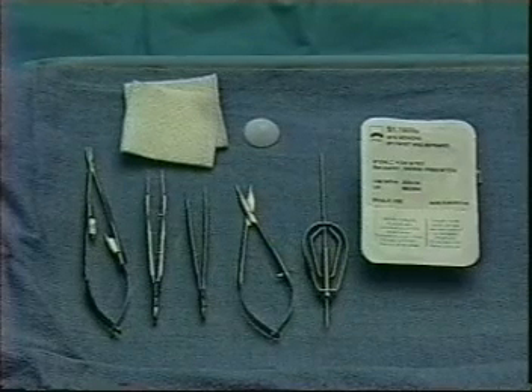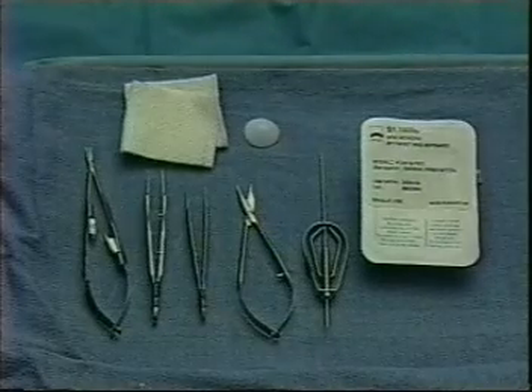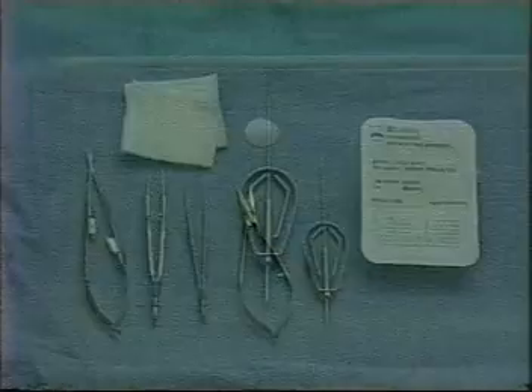The equipment needed is a basic ophthalmic plastic suture set, the Mini Monoca and the inserter. The local anesthetic used is xylocaine 2% with epinephrine for hemostasis.